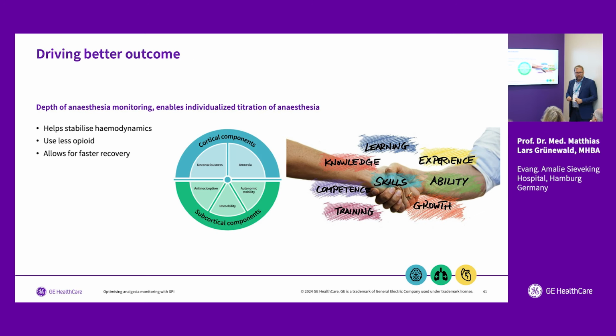Okay, driving better outcome is the goal. I think monitoring by using entropy and surgical pleth index helps to stabilize hemodynamics. I've shown you less opioids and faster recovery. And it at least needs a good anesthesiologist, so it needs us to be there in place.